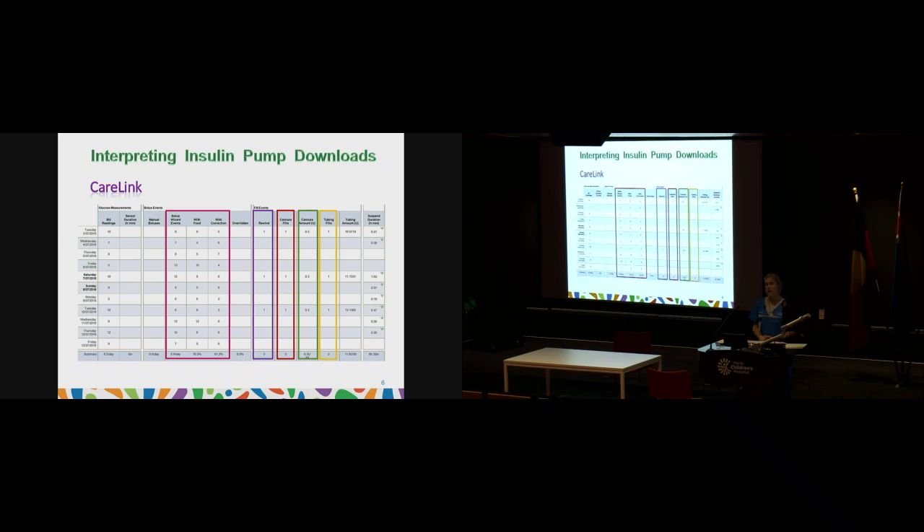Looking at what uploads actually look like — this is from CareLink, the first reporting page for Medtronic pumps. It shows the number of times you've done a blood glucose level or entered one into the pump, and your bolus wizard events: how many times you've bolused and whether it was with a meal or a correction. This side shows how often you're changing your pump site — this person is changing every three days, filling the cannula and tubing. Down the side it shows how long the pump has been suspended each day. This is specific to the CareLink Medtronic system.